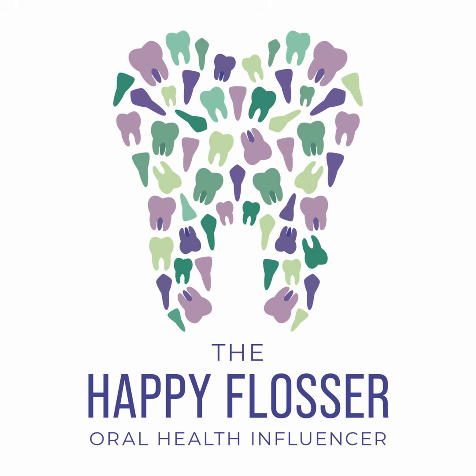So as you're seating the tray from back to front, you are then using your fingers to make sure you're pulling the lip out and the impression is up against the teeth. So maintain gentle pressure once you have it seated until that material is set. You have to wait for full set. I will tell you, if you take an impression out of the mouth too soon, you are just going to end up with such a huge mess. So don't rush this whole thing.